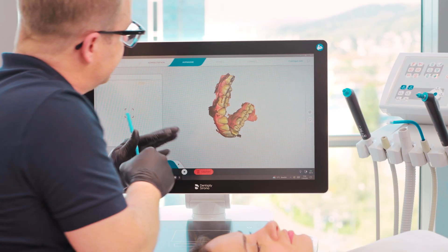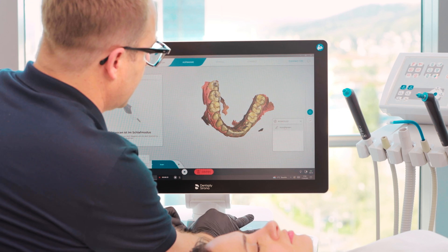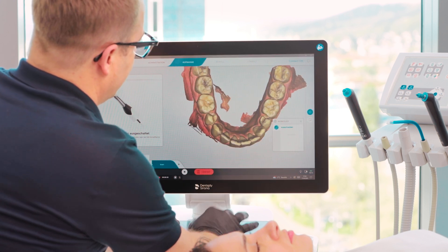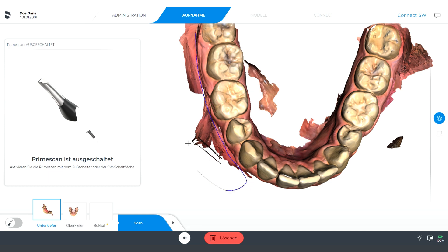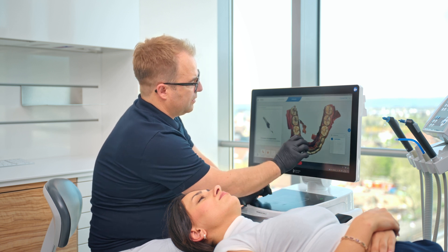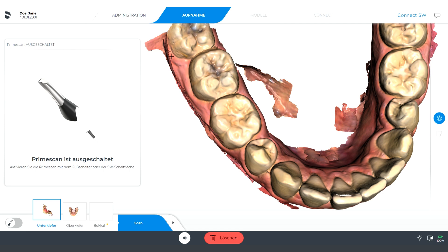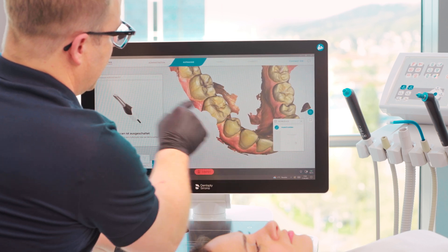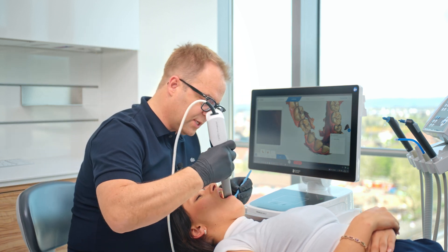Let's check our scan. I have a little bit of excess here on this side — I will cut that away just to see where I need to re-scan. This looks good. I will re-scan this area quickly. Open please.